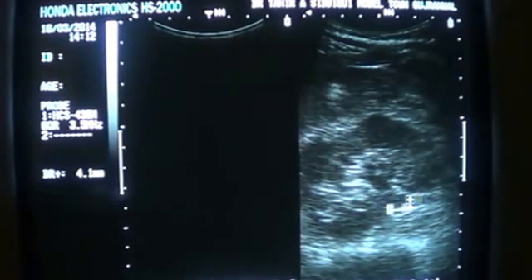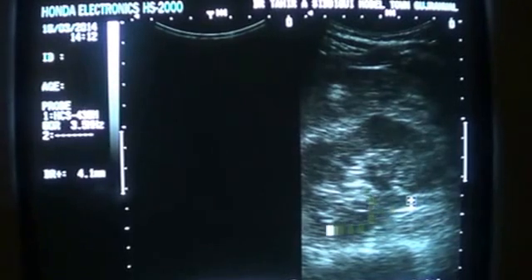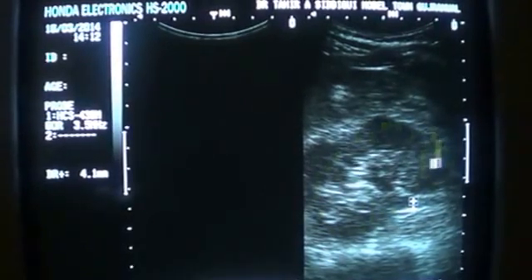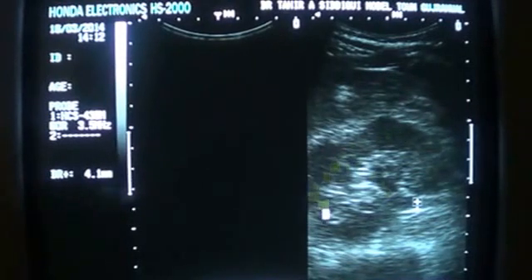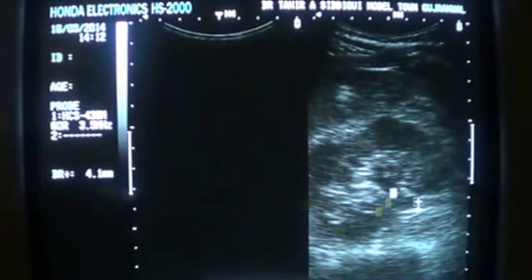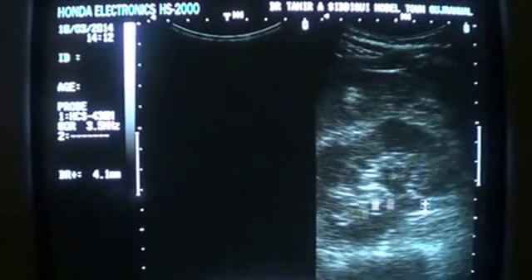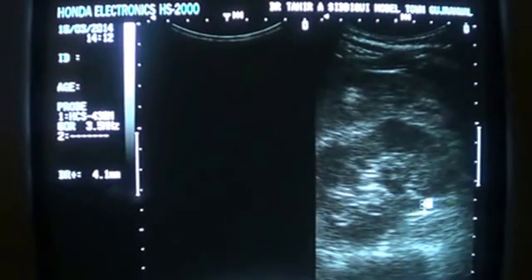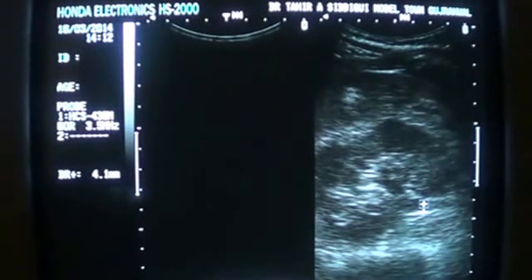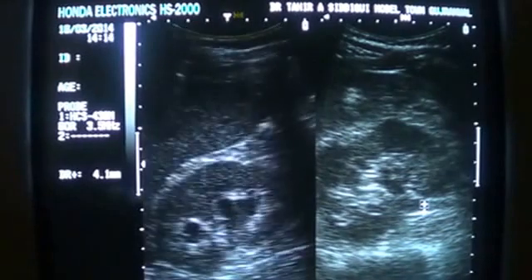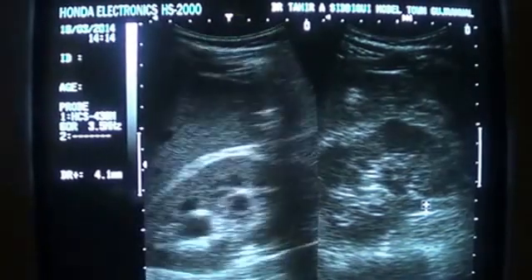This is the left kidney — this is the lower pole, the upper pole — and there you see the calices. They are not dilated, and the proximal ureter is showing normal dimension. This is a normal kidney, and there is a reason: this is for comparison purposes with the other kidney now.